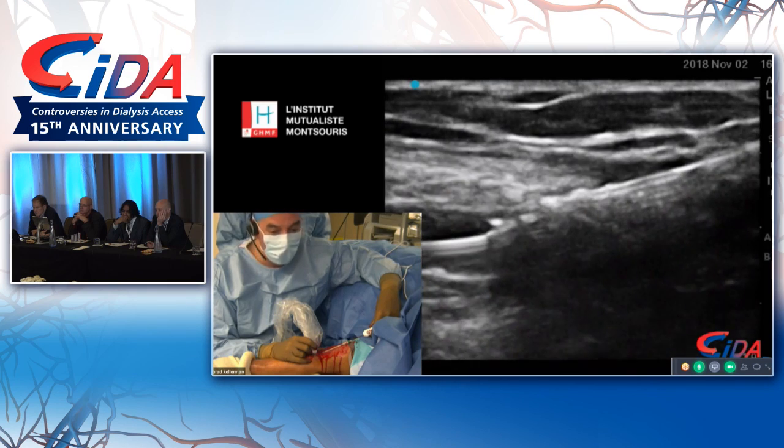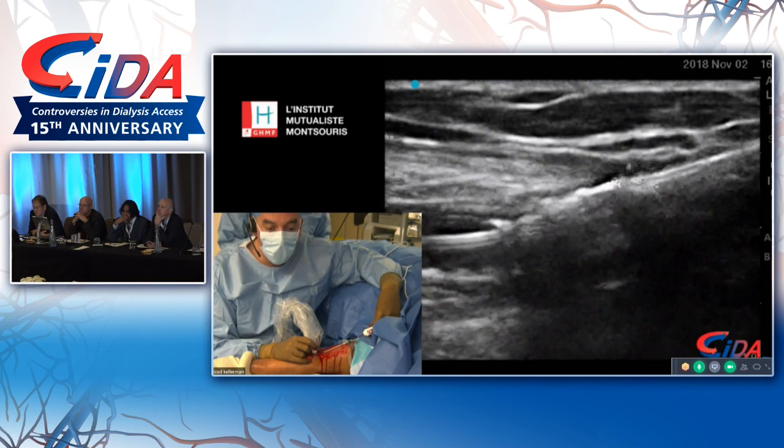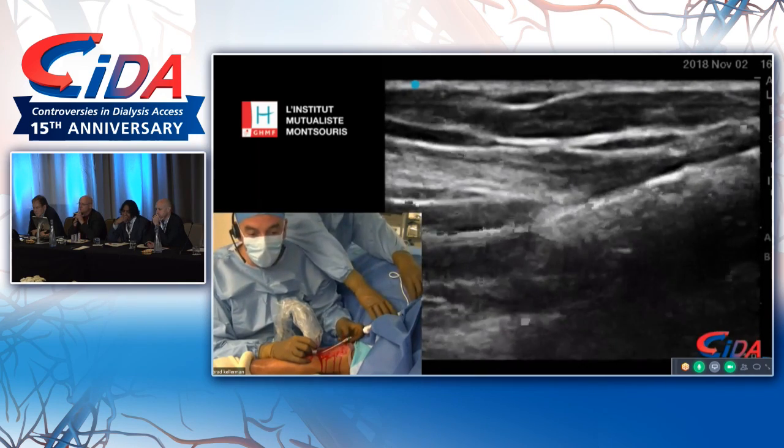Okay. Do one more. So, okay, that's good. So we're done. The anastomosis is completed, as you will see shortly.